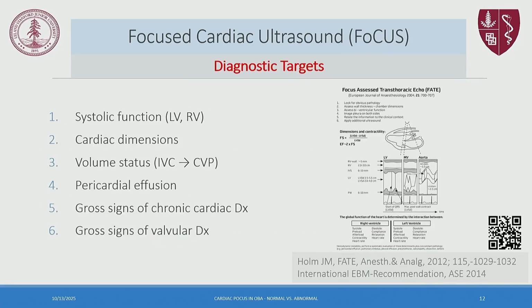And what are the diagnostic targets that you have to be able to diagnose when performing focused cardiac ultrasound? You have to be able to assess systolic function of the left ventricle and right ventricle, the cardiac dimensions, the volume status, see if there's pericardial effusion, yes or no, and identify gross signs of chronic cardiac disease and gross signs of valvular disease. And what is important in focused cardiac ultrasound is a targeted diagnostic test. So these diagnostic targets you want to be able to answer with yes or no, not more. That's a focused cardiac ultrasound.